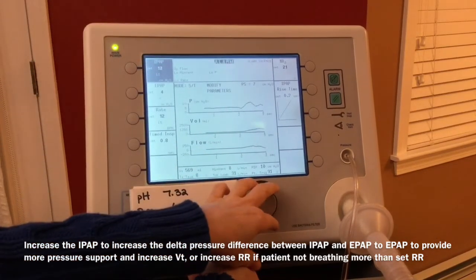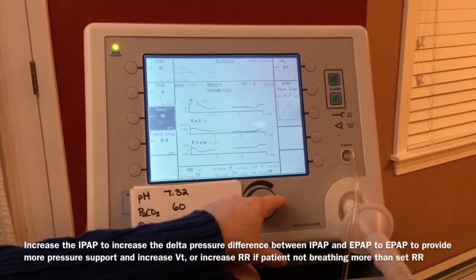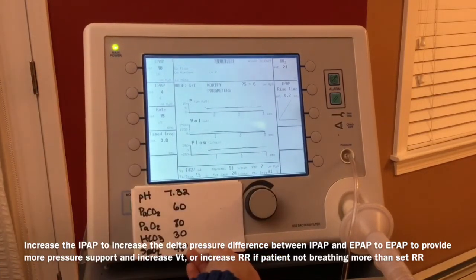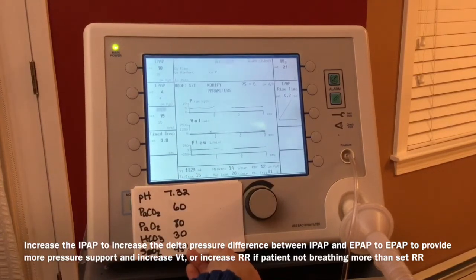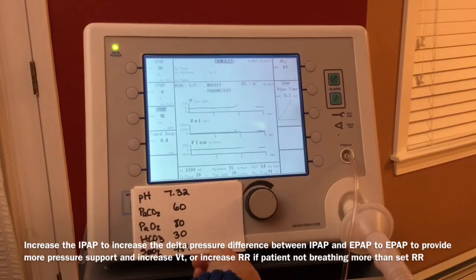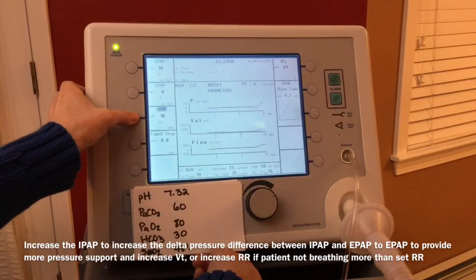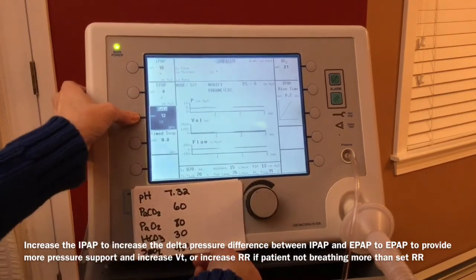Or you can increase the respiratory rate to overdrive the patient's effort to increase minute ventilation. The preferred move would be to increase IPAP so that the patient is able to continuously synchronize with the machine. I'm going to return the rate back down to 12. Let's do another blood gas.